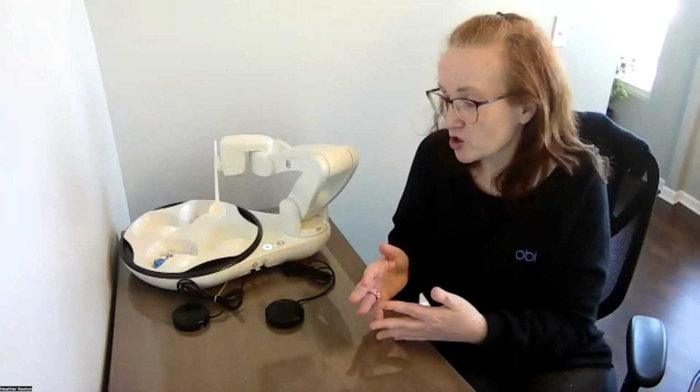So if you're someone who is eating at the same table, in the same chair, and maybe you don't have postural shifts or have enough trunk control that you can move to get your bite, you may not have to reteach it. But I do recommend reteaching it for every meal for anyone with limited trunk control or with positioning challenges.